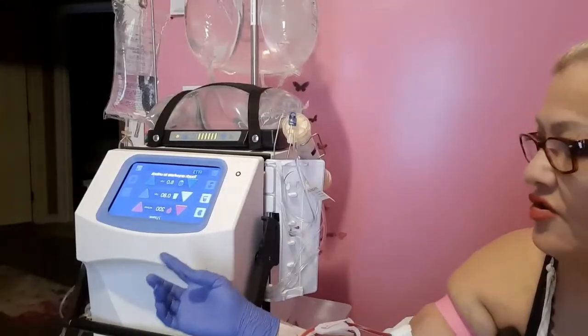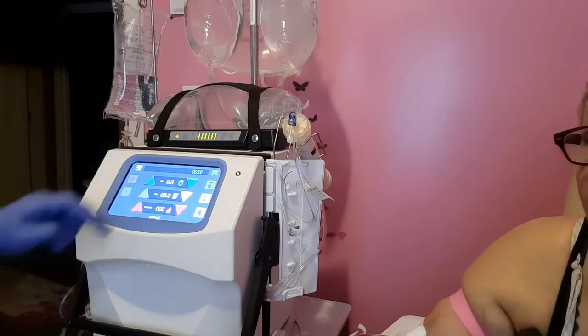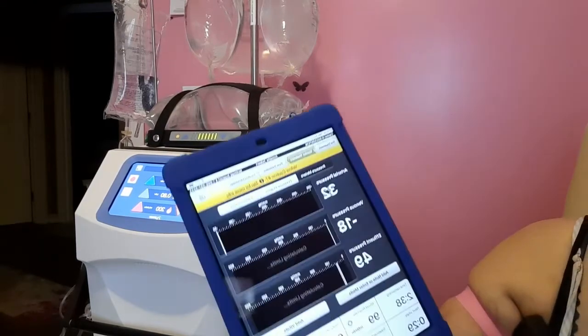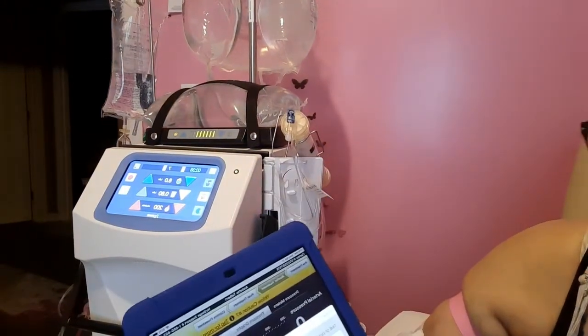Alright, so we have to go to the machine. Hofstra, just touch the screen. Hit 1, 2, 3. Okay, and hit the green kidney. That's for treatment. Now the machine will start. And now I'm going to get some live numbers, pressure numbers on this iPad. Okay, so you hear it? You hear the pump revving up?